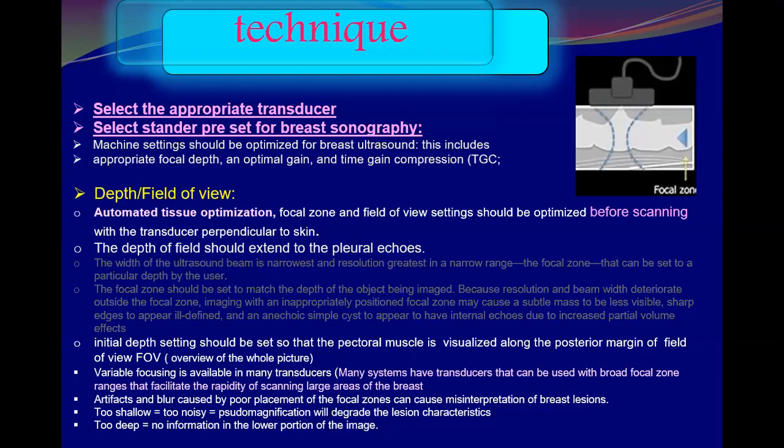Now we are talking about the focal zones. Regarding the focal zones, we have to preset them before scanning. And where exactly do we put it?